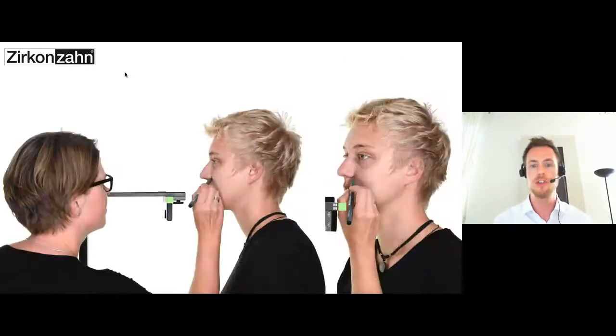We're using the same dots, the same references as camber, but the plane in the end is called the alatragus plane because it is measured onto the skin. And if I have this information, the angulation of the alatragus plane, on the left and the right facial side obviously, then I can reproduce the occlusion plane. We could do that manually, we could do that also virtually. This is just a picture marking the patient's face.